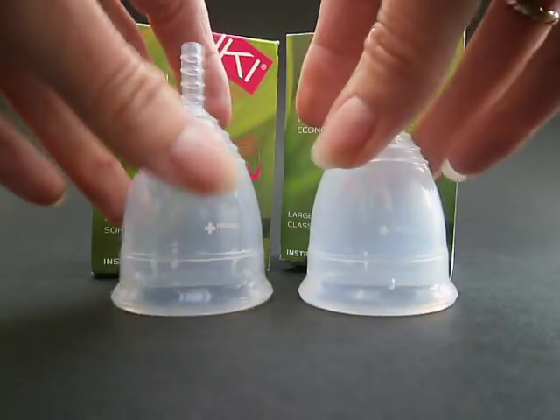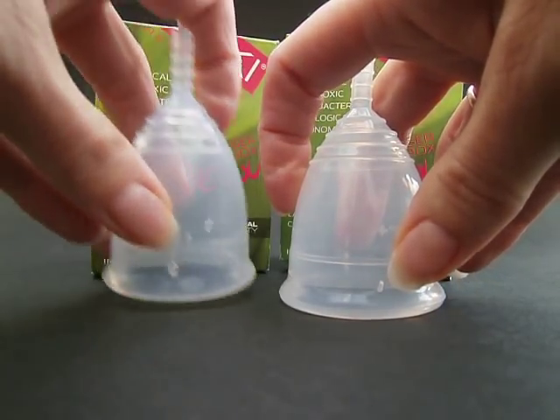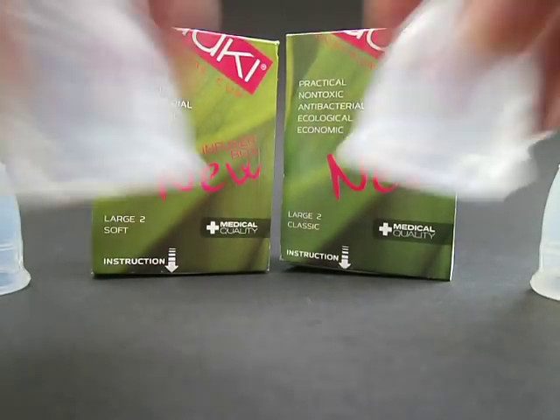The other difference that I've noticed is in the holes. The holes are larger in the soft cups and much, much smaller in the classic. Same with the small as well — they're all like this.